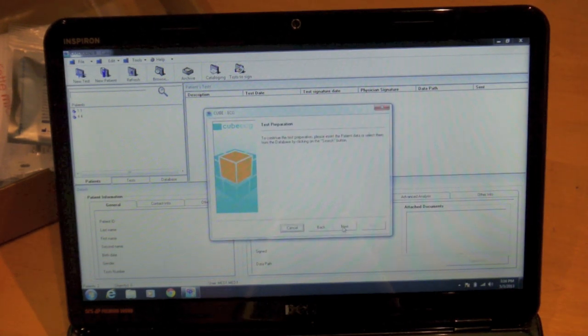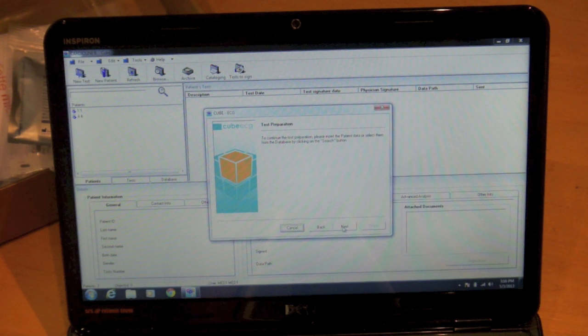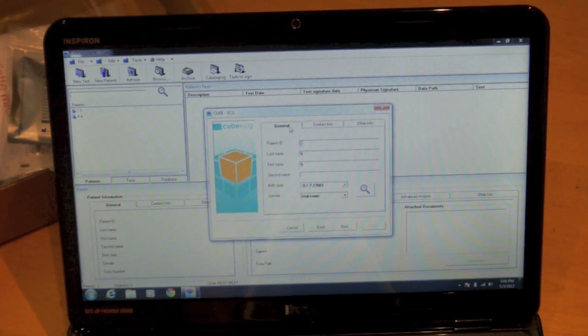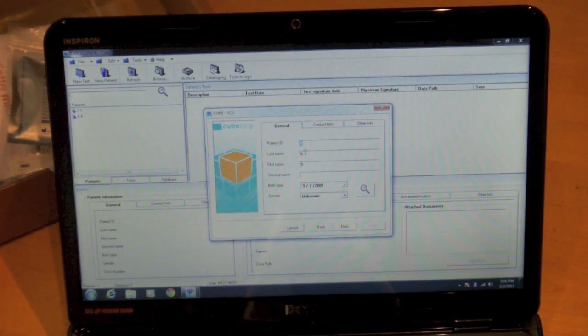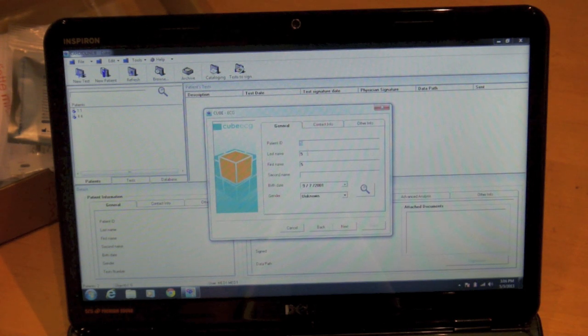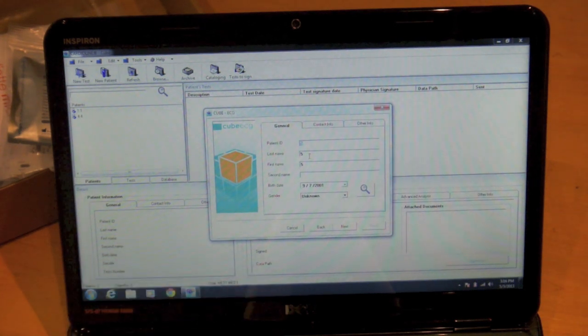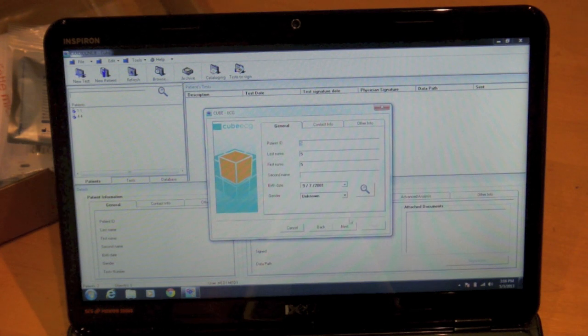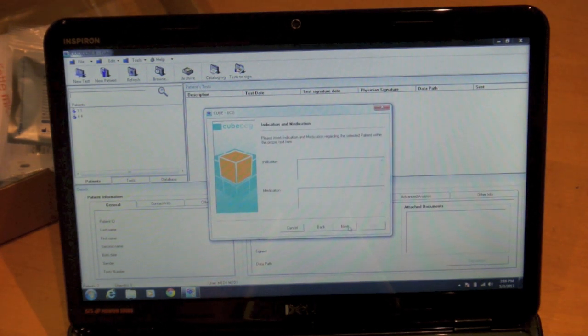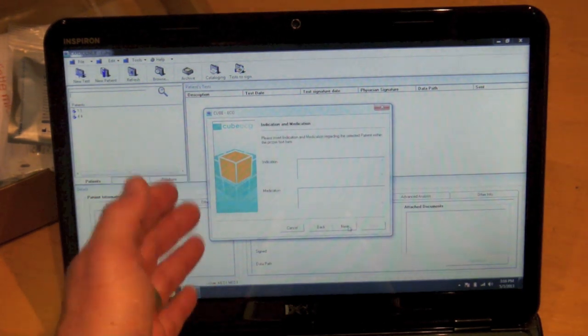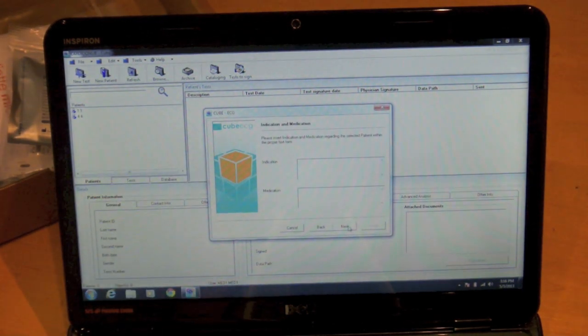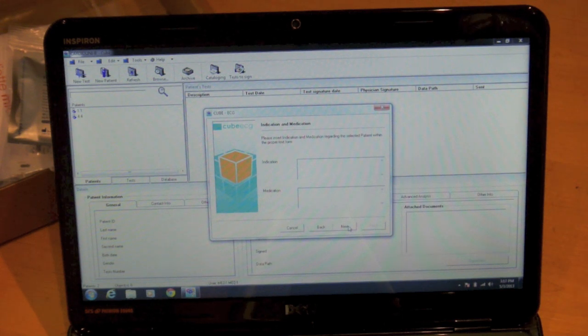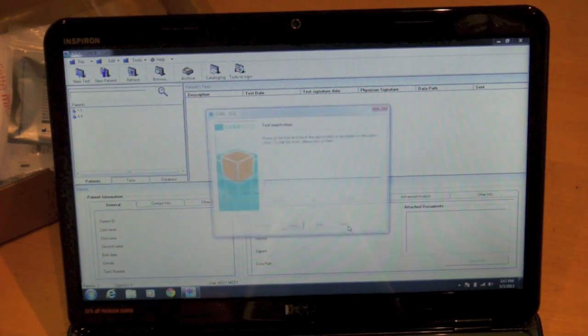It's going to tell me to select the patient. I'm just going to use the next patient ID here. You could enter patient data at this point or search for an existing patient. I'll just create a new one.